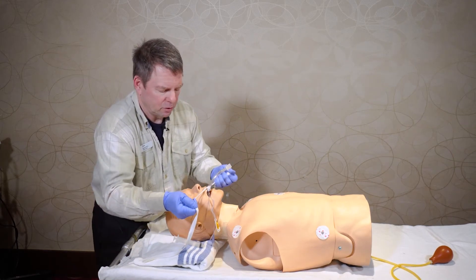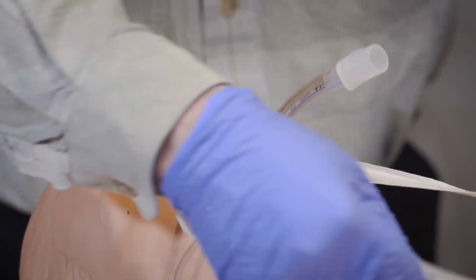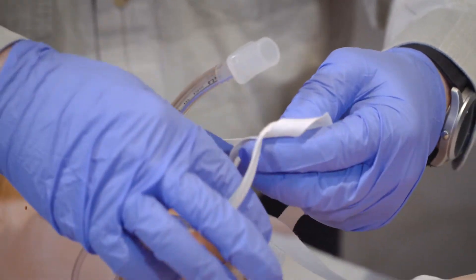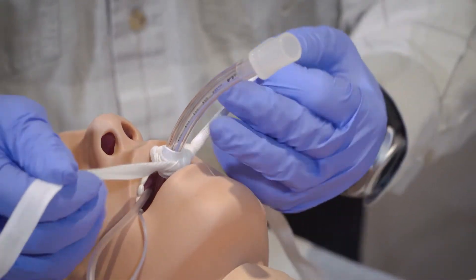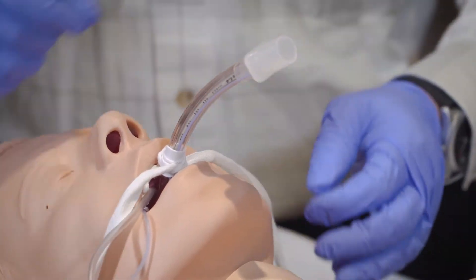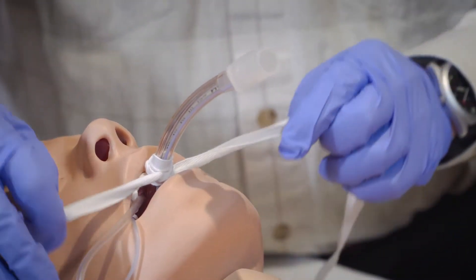One is going to go to the right and one to the left, and then you're going to bring them underneath the endotracheal tube and do a simple knot on the bottom of the tube, pulling the two ends so that it's tight. That will prevent the tube from sliding up and down.